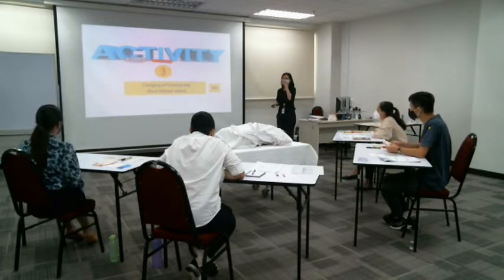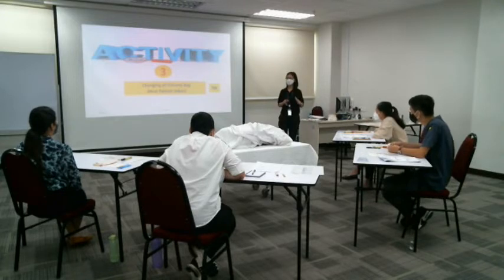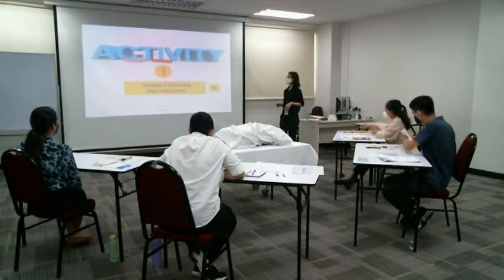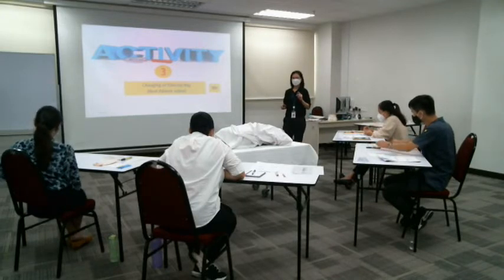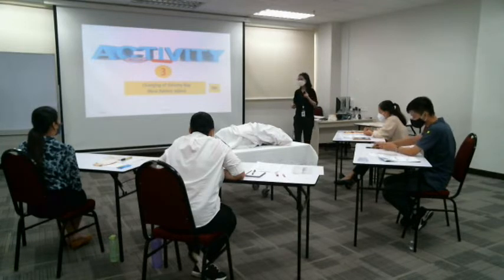Okay, look at the consistency of the stool. Try to locate where is the side of the stoma, right? Whether it goes with the consistency of the stool or not. Okay, and it is changing of the ostomy bag, which is using the two-piece pouching system.